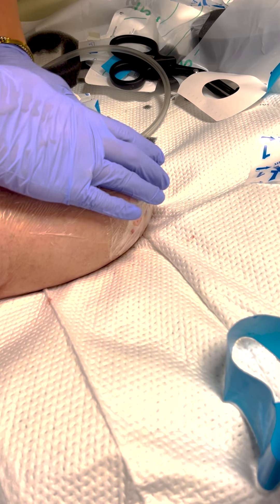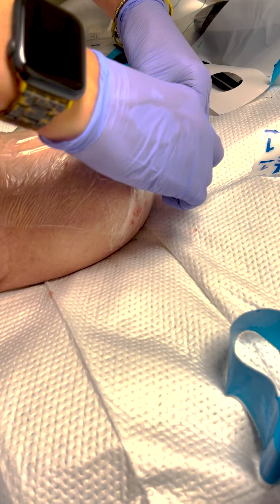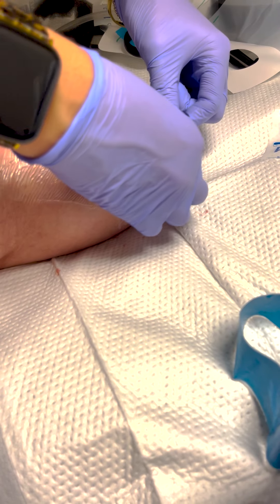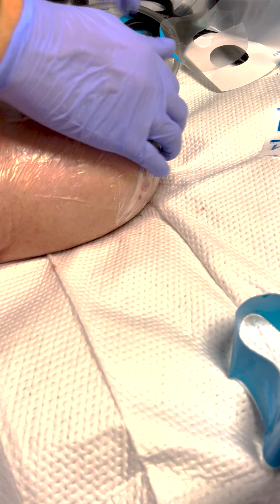Then we're going to attach this little piece, which is the actual tubing. Put some pressure on there — and I'm probably going to put one more piece over top of it because this one's always a little chunky. There we go.